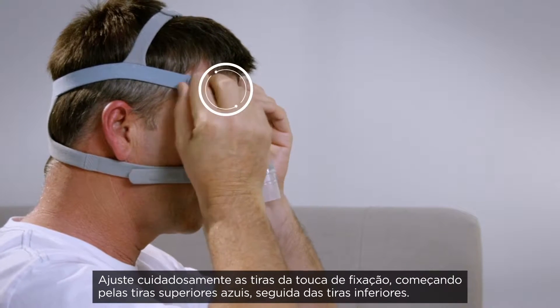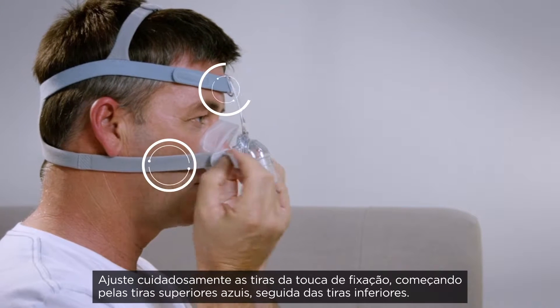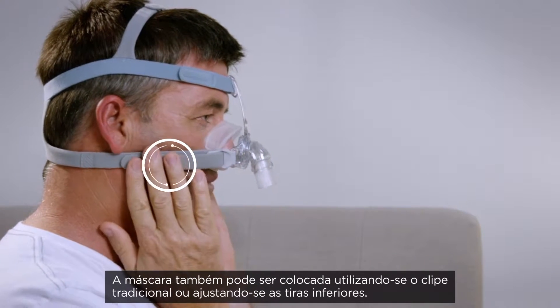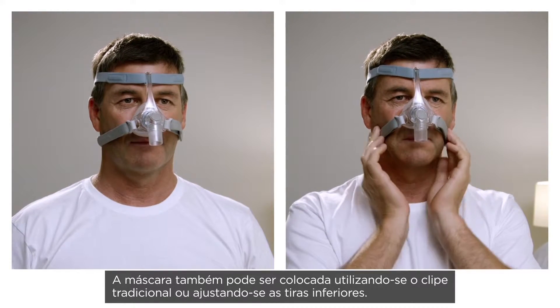Gently tighten the headgear straps, starting with the blue top strap, followed by the bottom straps. The mask can also be put on by using either the traditional clip or with the bottom strap adhesive.